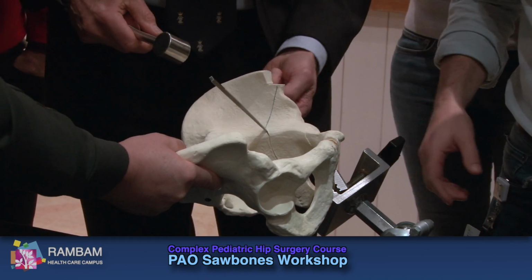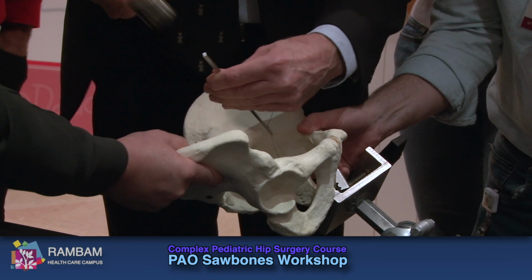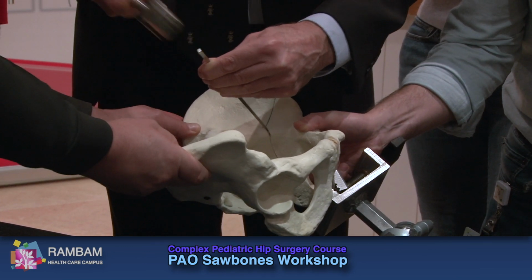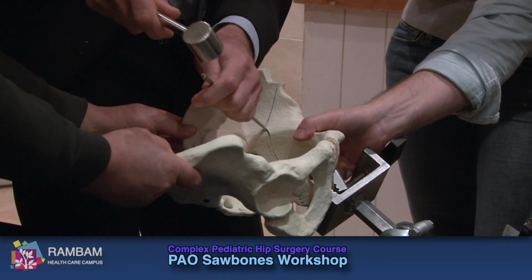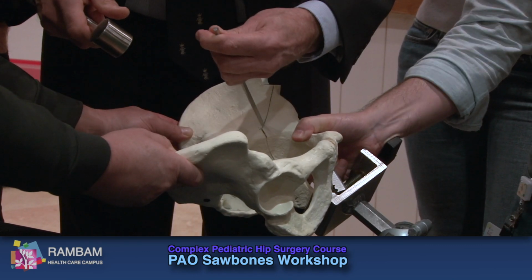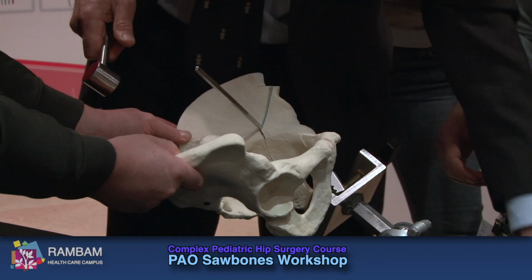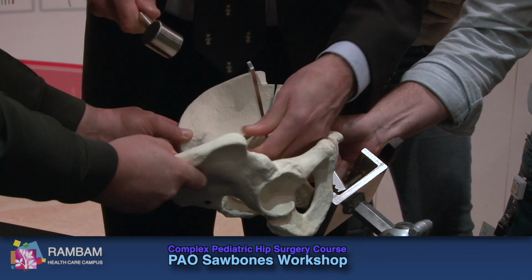And you start to open up here, so I'm coming back here. Let's work at this a bit. Come out the back here. Keep working at it. If you get stuck and you can't get it out, just take another one. Then that one comes out again.